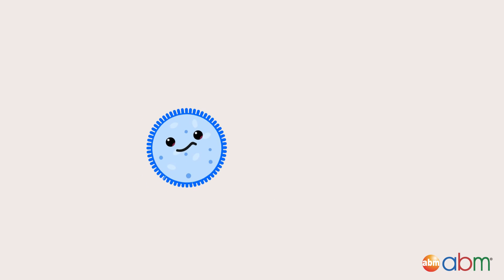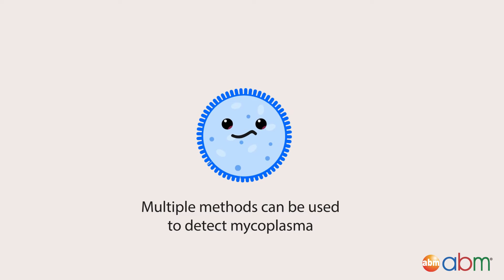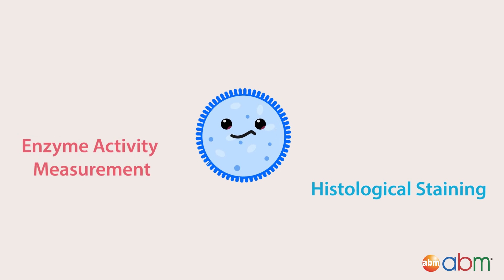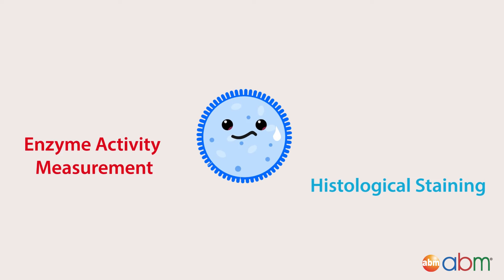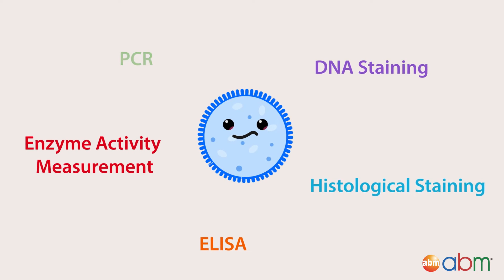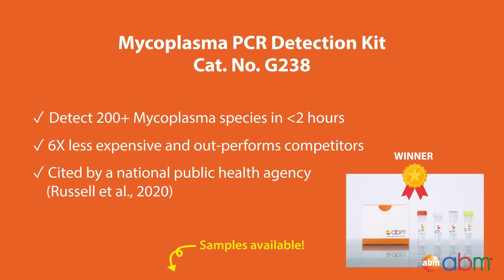Luckily, there are multiple methods that can be used to detect mycoplasma, which includes histological staining, enzyme activity measurements, ELISA, DNA staining, and PCR. ABM provides a quick and efficient mycoplasma PCR detection kit that is capable of detecting over 200 strains of mycoplasma within a few hours.